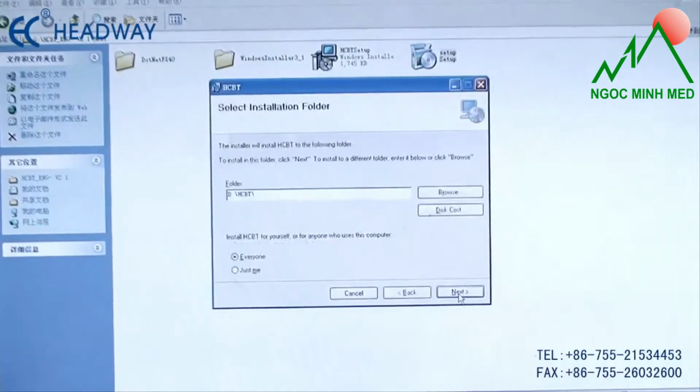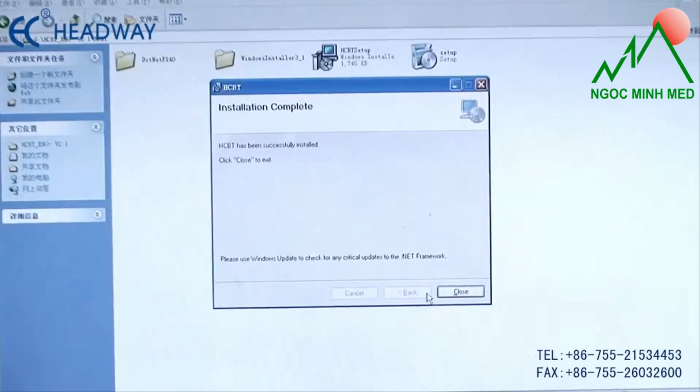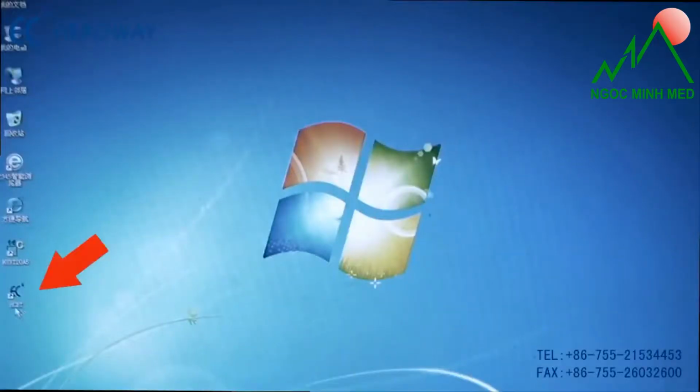After initialization of the component is finished automatically, the setup procedure can begin. According to the tips in the prompt dialog box, click Install and choose Installing Components. The system will complete the installation process automatically. The program menu and desktop will generate a shortcut automatically. Click 13C infrared spectrometer in the program menu bar or double-click the desktop shortcut icon to start the procedure.